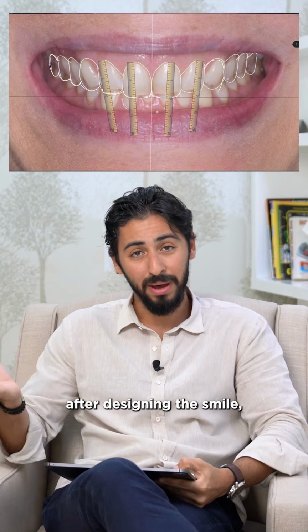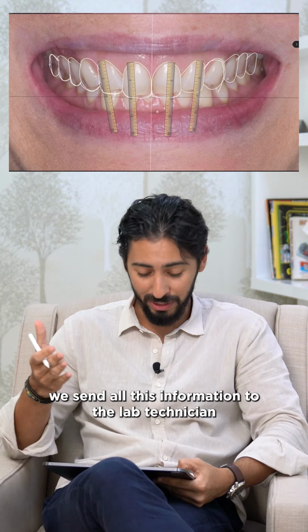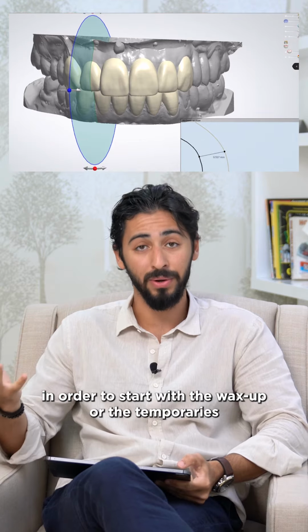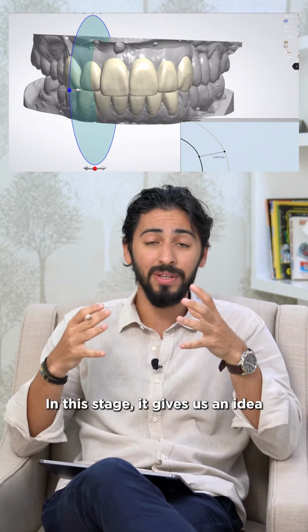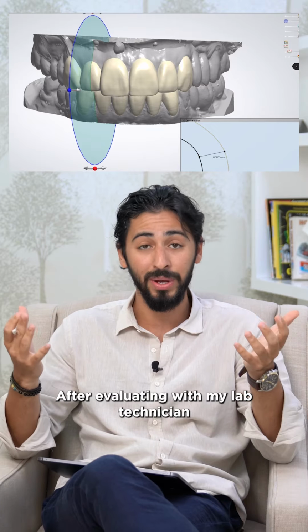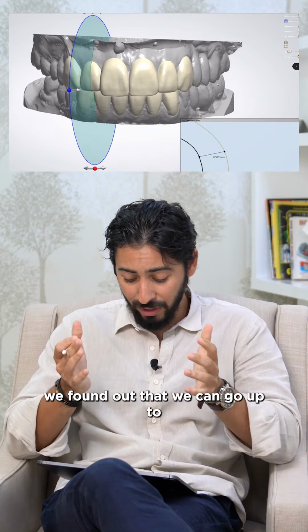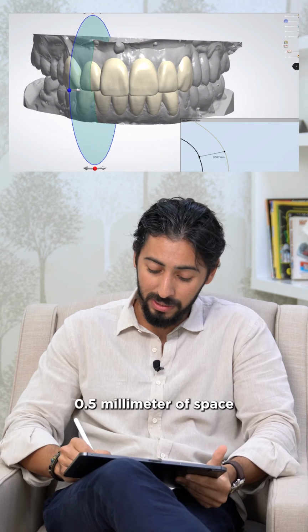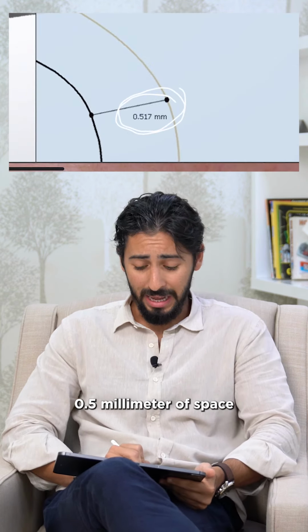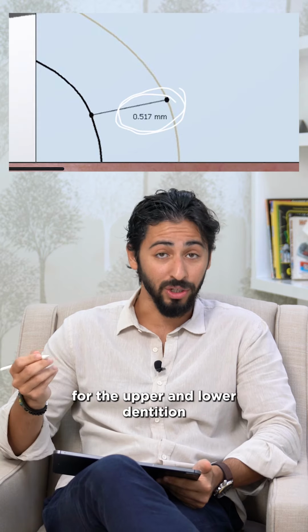After designing the smile, we send all of this information to the lab technician in order to start with the wax-up or the temporaries. In this stage, it gives us an idea of whether we need to touch the teeth or not. And after evaluating it with my lab technician, we found out that we can go up to 0.5 millimeter of space for the upper and the lower dentition.